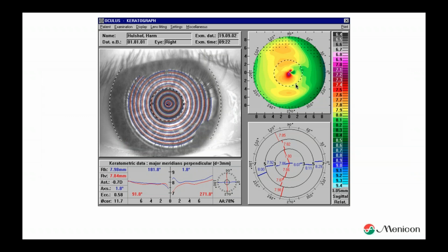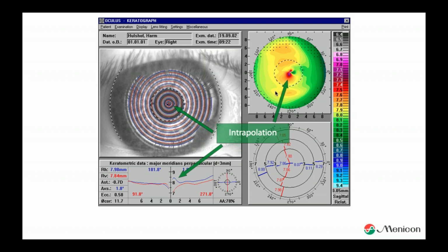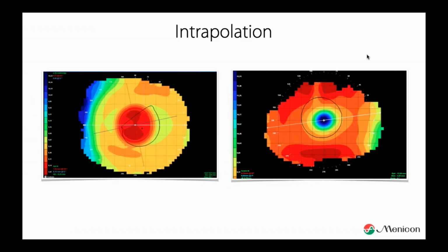Some people said to me, okay, this is for an Oculus, this is only working for topographers with a larger cone, and that's a wrong assumption as well. Why? This is from a Medmont. It has a smaller cone. It's almost pressed into your orbit, but you will see that as well.